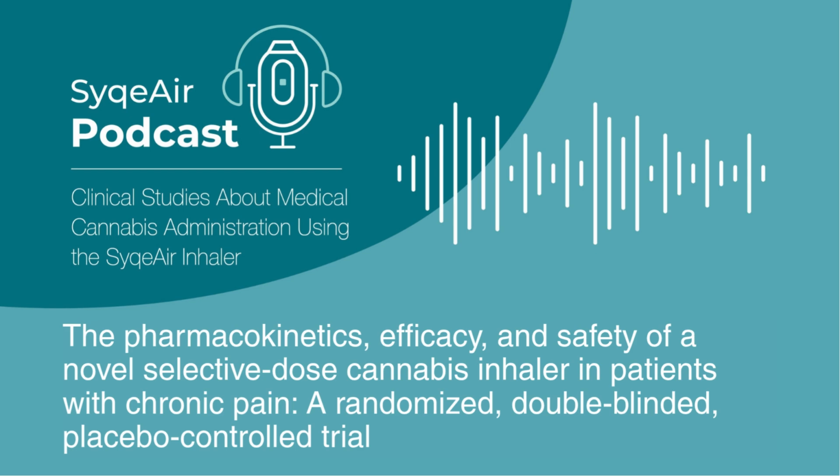Yeah. Consistency, reliability. Which brings us neatly back to this study and the SyqeAir Inhaler. Right. So what is this device, according to the paper? Okay, it's described as portable, handheld, battery-operated, and it uses software control. The technology is called thermal selective dose inhalation, or TSDI. And it uses raw plant material. Yeah, granulated raw plants. In this study, it was specifically cannabis flower, or flos, as they call it. And it's designed to aerosolize this material to deliver multiple doses.